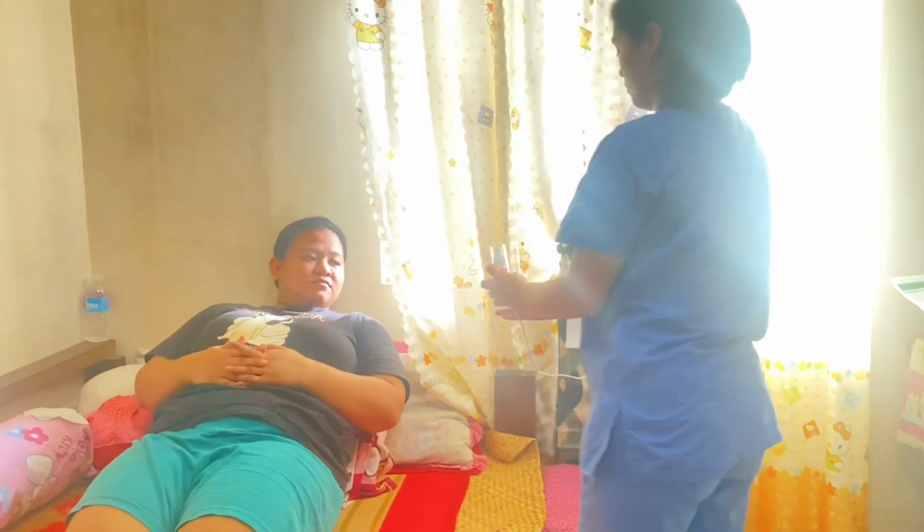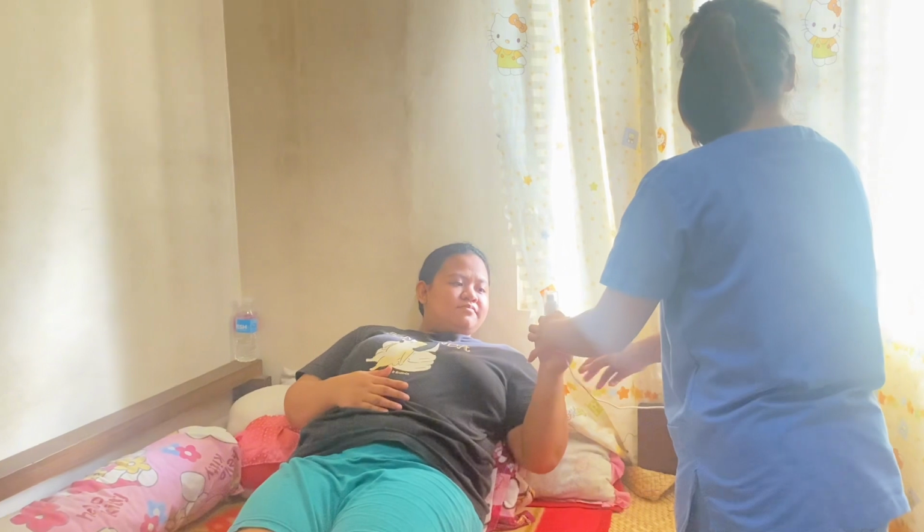And let the client hold the mouthpiece between the lips with gentle pressure.